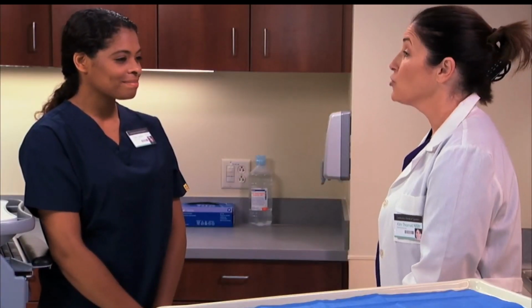Okay. Now, do you have all the equipment you need? Yes. I have the irrigation set in the room. I also brought a waterproof pad to help keep the patient and bedding dry, and gloves to put on when I administer the medication. Now I'm going to perform hand hygiene. Okay.